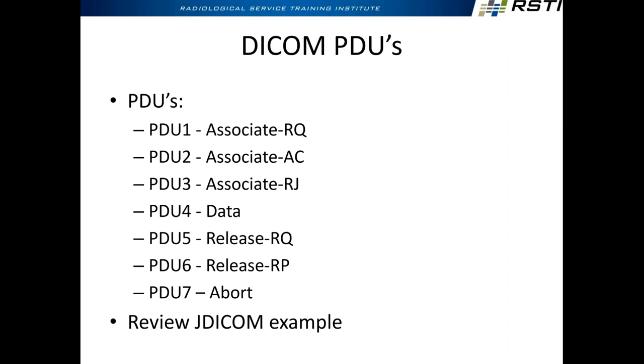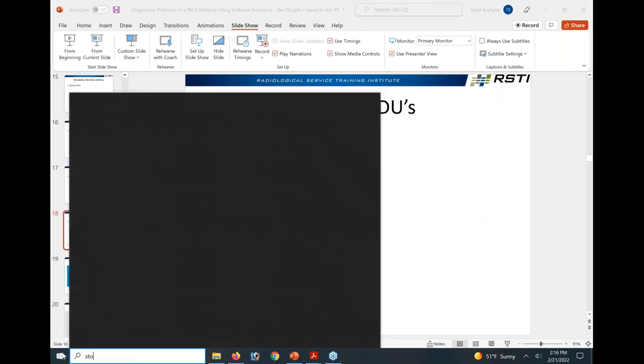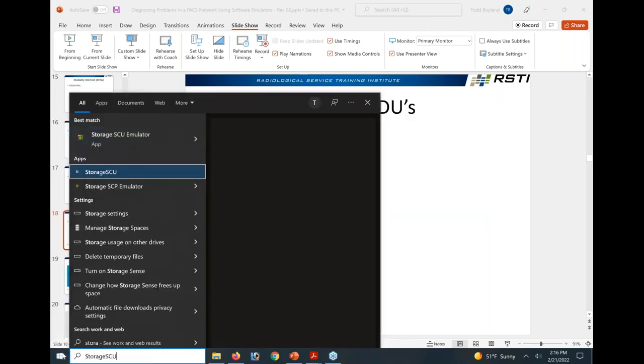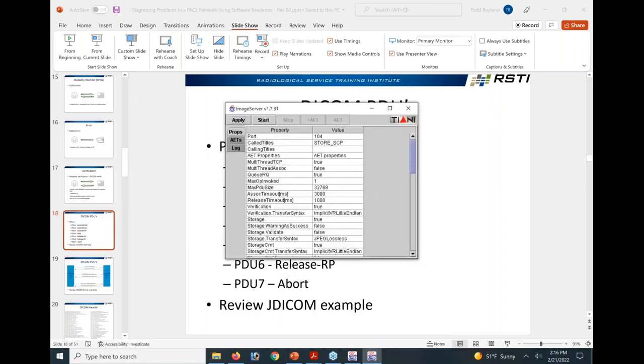So all that, I mean, it sounds complicated. I had a real good one just recently. I had a Hologic Selenia that I was adding a worklist to. It could echo, it could ping, but no data. Never gave data. And I chased my tail for a good hour on it before I found out that their whole HIS/RIS system crashed. And it crashed exactly when I was in there adding the new worklist. Well, they blamed me. They said I took it down. I was like, your worklist must be really weak, man. Your security. I pinged your worklist and took it down?